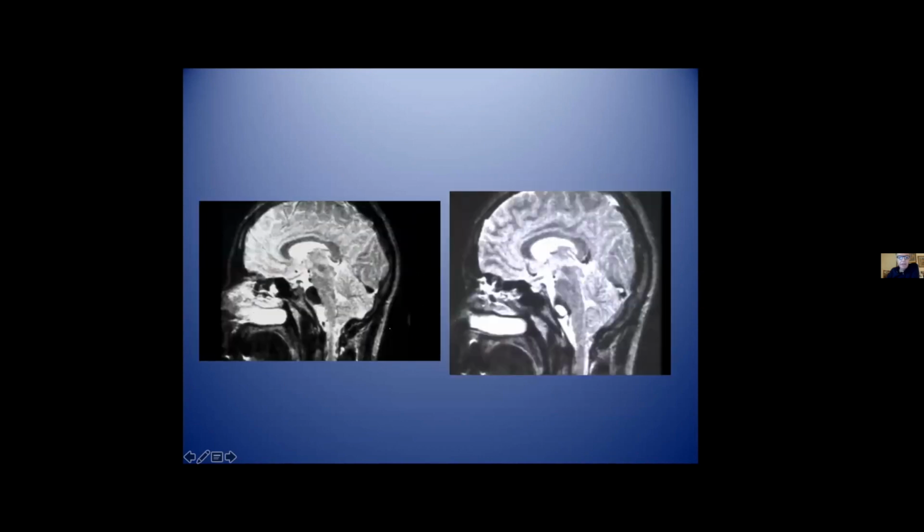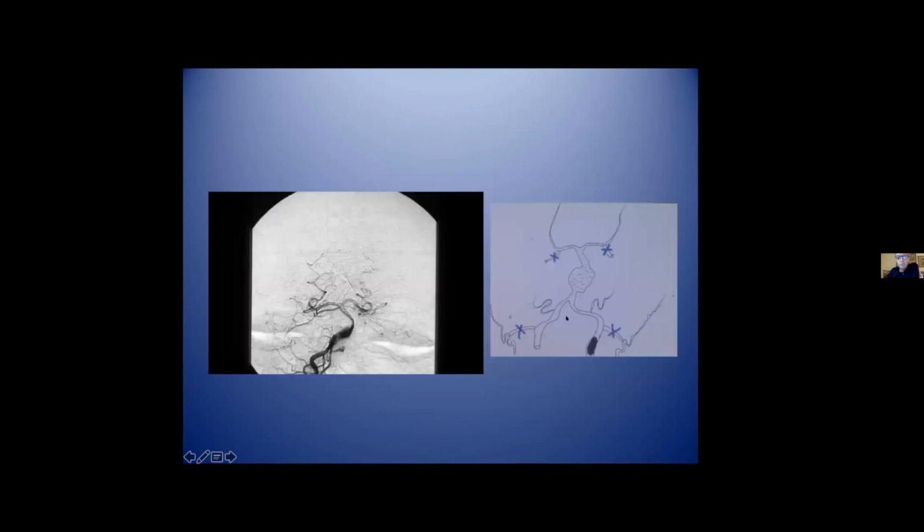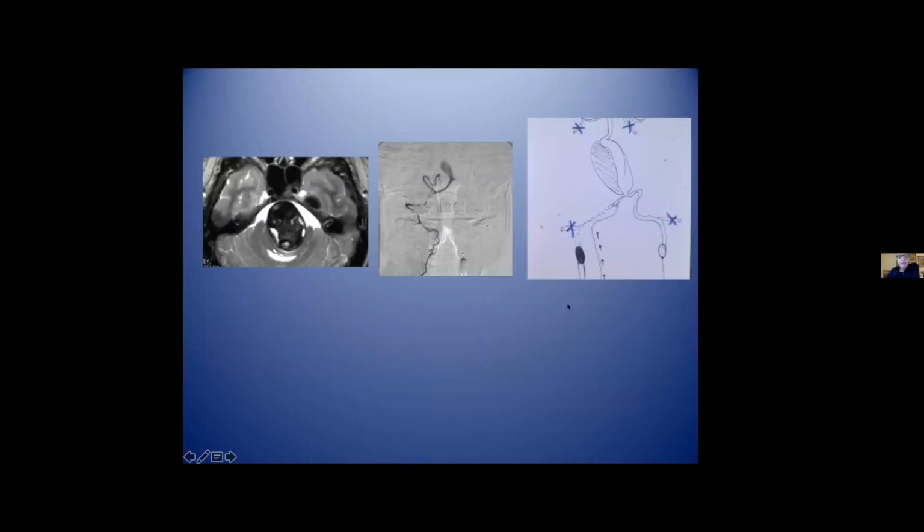To start, I sacrifice 1 vertebral artery, and this is the MR control. You have some reduction in the flow. Few years later, the patient don't have the posterior communicant artery and don't have open functional anastomosis of the vertebra. But I decide to treat it with occlusion of the second vertebral and finally the basilar artery.